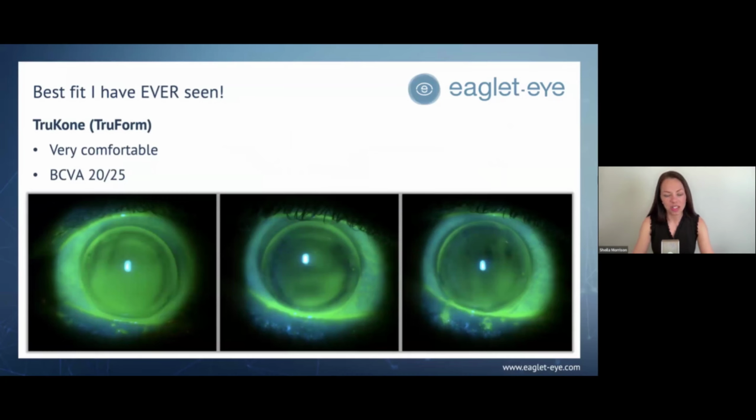He had good success with the comfort, and then our fiddling around became more about how do we optimize his multifocal optic. So he felt like his lens fit was great right off the bat. So just some really great examples of how we can now embark into the new generation of fitting lenses, like I said, similar to corneal GPs, analogous to OrthoK, empirical design based on shape. And we've done this for a very long time with other topographers, and now we're using it with the ESP as well. So things have been really fun in the clinic using profilometry for our corneal GP fitting.